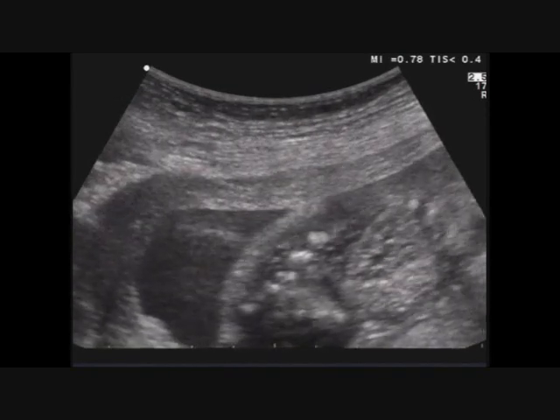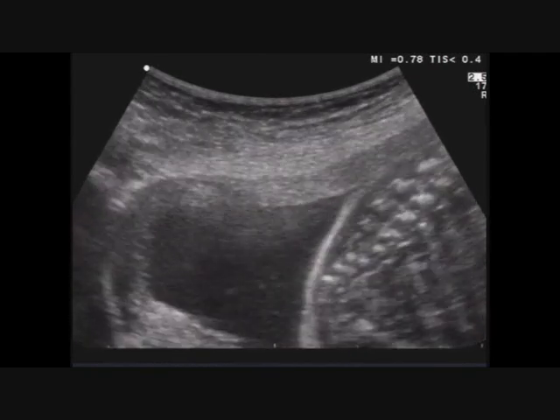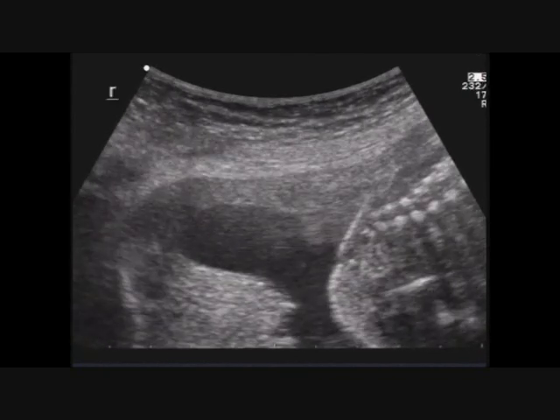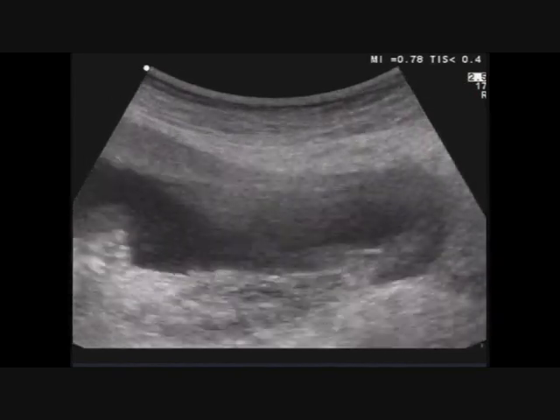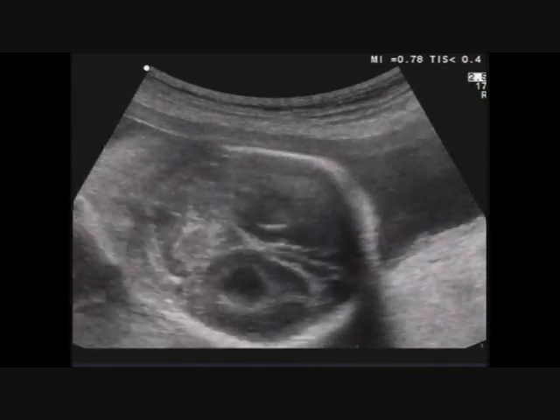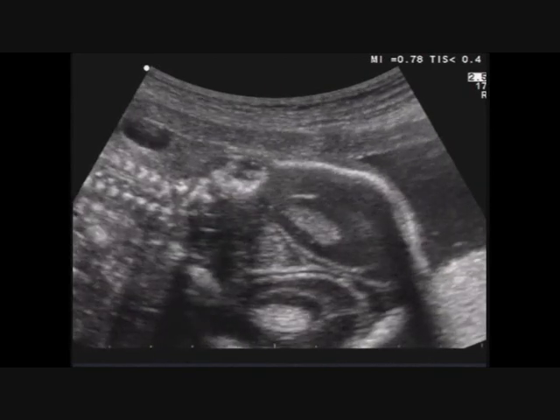I showed you the sacrum, and why? Because there is the possibility of an association with spina bifida, though in this case we would have a malformation of the posterior fossa. I showed you the cervical part of the spinal column, and now we will repeat the principal sign.